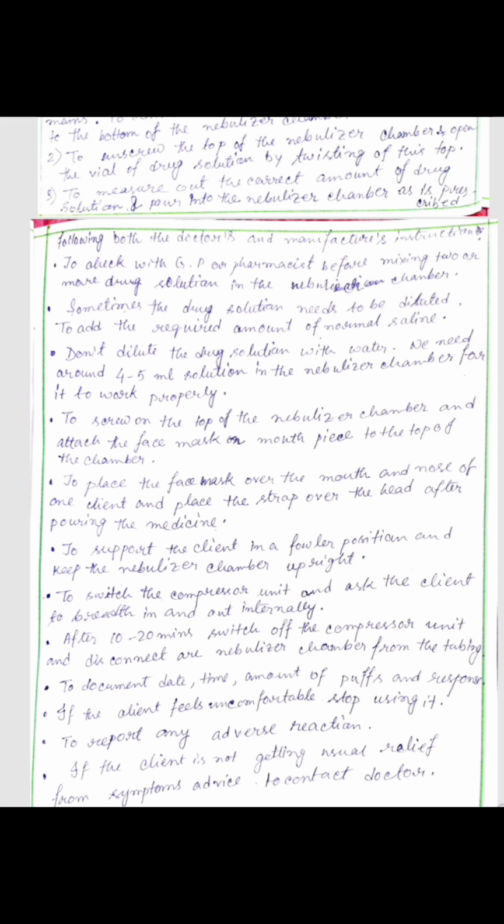After 10 to 20 minutes, switch off the compressor unit and disconnect the nebulizer chamber from the tubing.